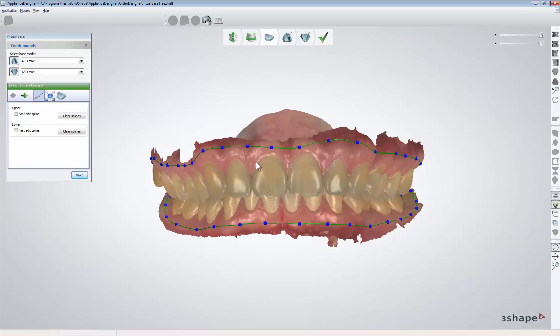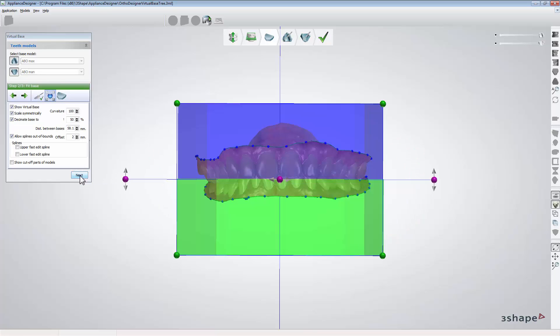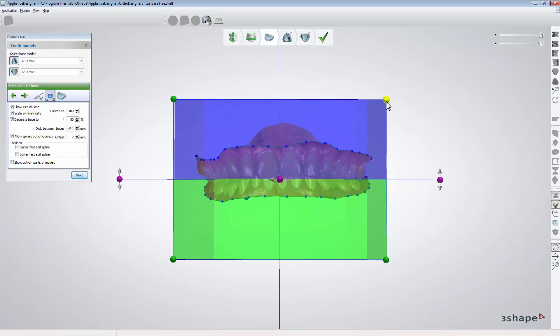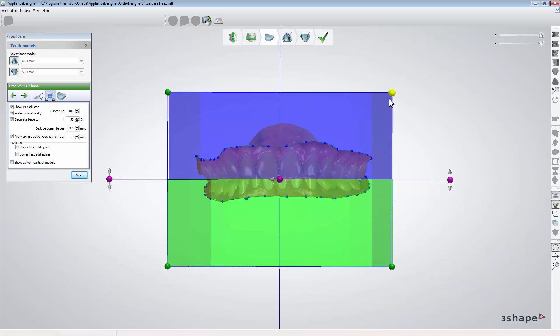When you are done, click next to get to the fit base step where software will divide models according to occlusal and sagittal planes set earlier. The software will automatically generate the area for the base but you can adjust it.